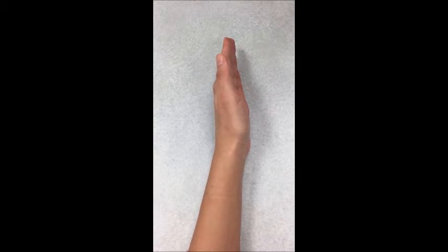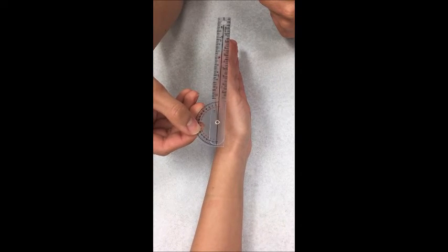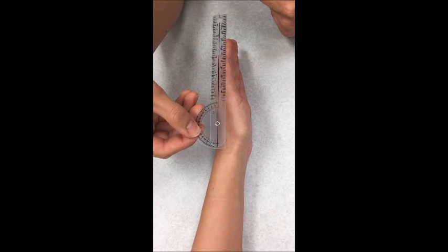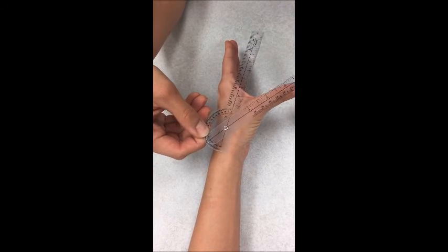The client is positioned in the same way described in the first method. The axis is at the junction of the thumb and index finger metacarpals. The stationary and movable bars are lined up together, parallel to the thumb and index finger metacarpals. The therapist will ask the patient to abduct the thumb. The therapist will follow the thumb with the movable bar of the goniometer.